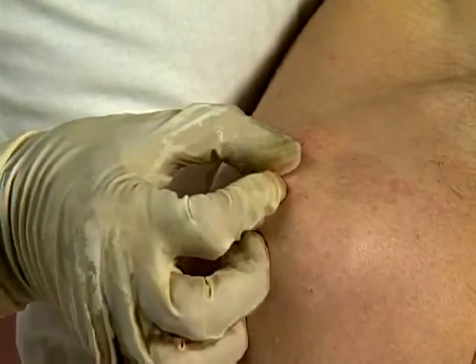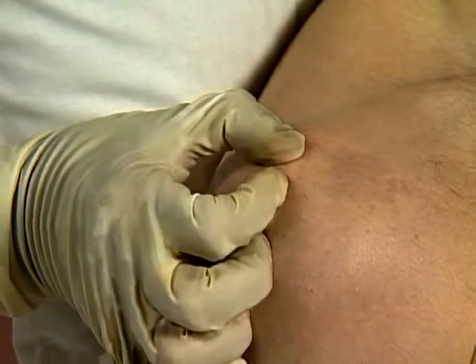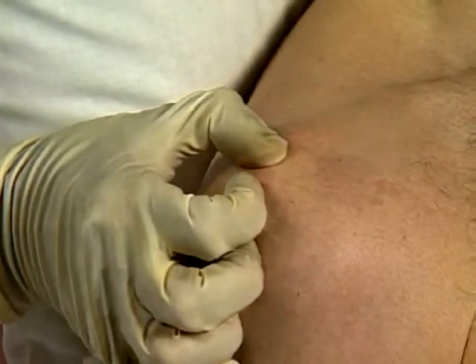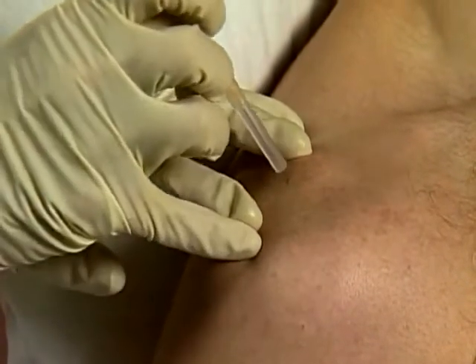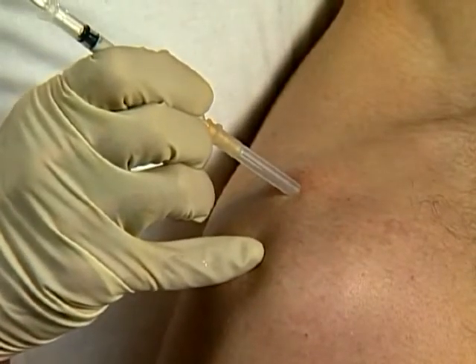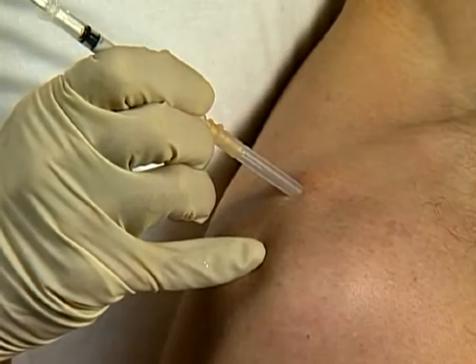Find the lateral aspect of the acromion. A thumb's width medially, feel for the step, which is the end of the clavicle. Mark entry point at joint line. Clean and firmly stretch the skin and rapidly insert needle perpendicularly. Angle slightly medially and inject as a bolus.